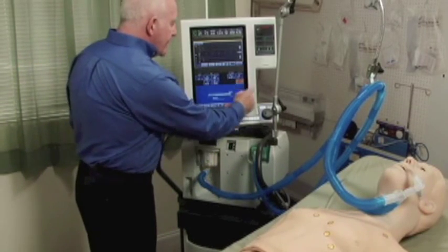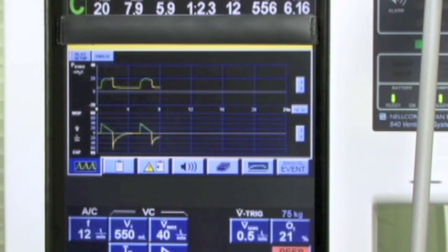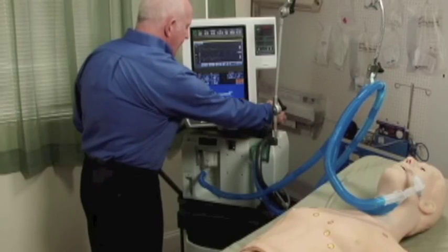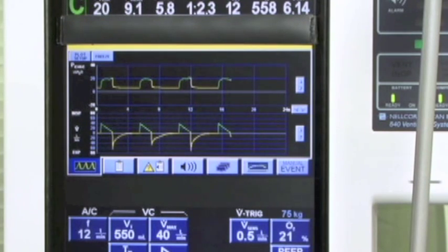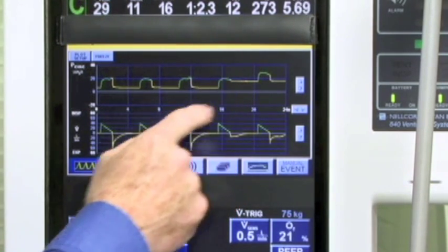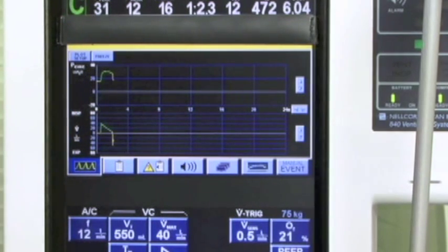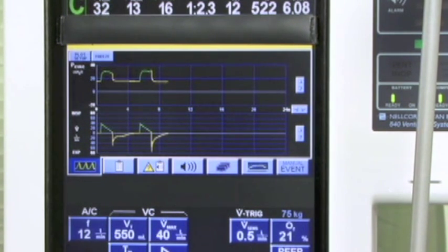I'll increase the PEEP to 15 centimeters of water. Notice the resultant increase in PEEP as well as the resultant increase in peak inflation pressures within a few seconds. The 3201 maintains the PEEP to peak pressure relationship throughout all PEEP levels.